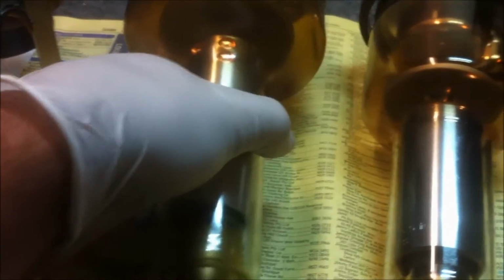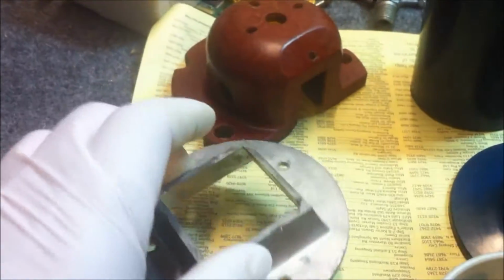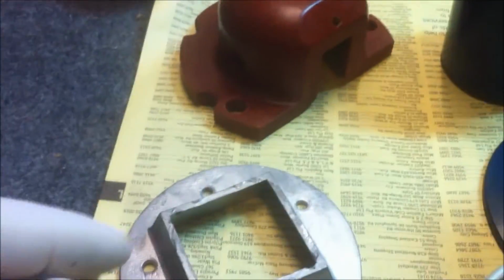I also kept these shrouds which sat around the actual tube themselves. If I can, actually I can't really, but yeah, it would just sit around this section of the tube in between the tube and the winding. I also kept this little fitting, don't know why, square peg in a round hole, might be useful one day.